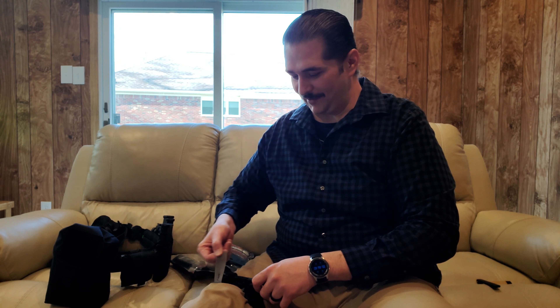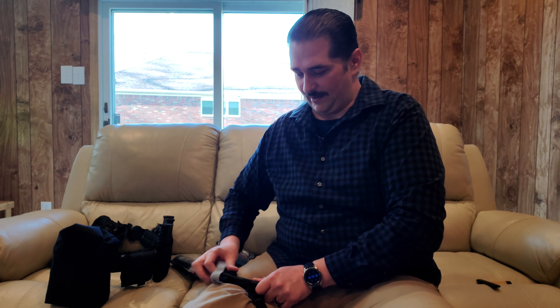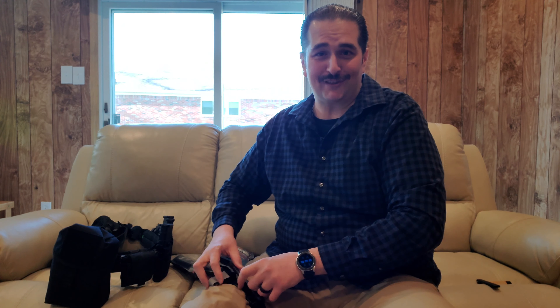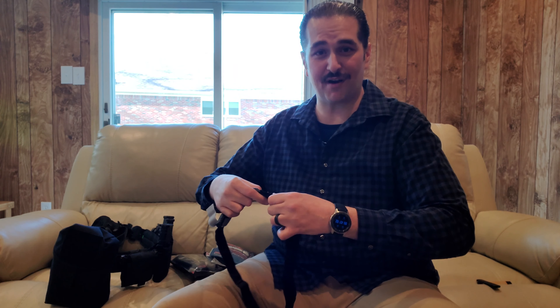Once you've turned the windlass enough, there's this little clip — you tuck it right in there. Then you put this velcro over it to secure it. Then you grab a sharpie — you always see sharpies in medkits, and if you wondered why, it's so you can write the time on the tourniquet. That's it — that is a regular guy from Jersey's interpretation of how to use a CAT tourniquet.